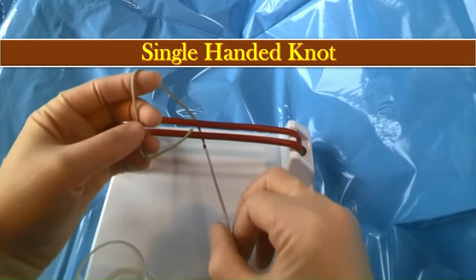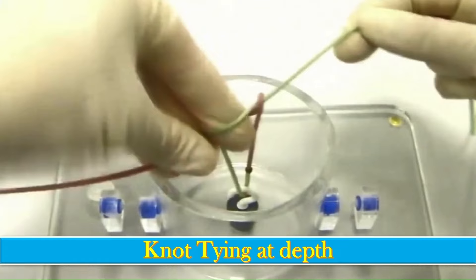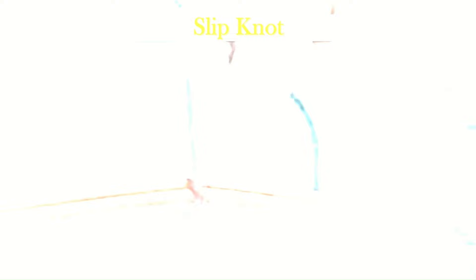Now we will quickly go through each type of knot again. Here we have the single-handed knot, in which one hand is used. This is the double-handed knot, in which two hands are used and both hands are crossed. Here is the surgeon knot, a more secure form in which we make two throws. Here we have knot tying in depth, the instrument tie knot, the granny knot — which is rarely used in surgery but we should learn the technique — the slip knot, and the Aberdeen knot.